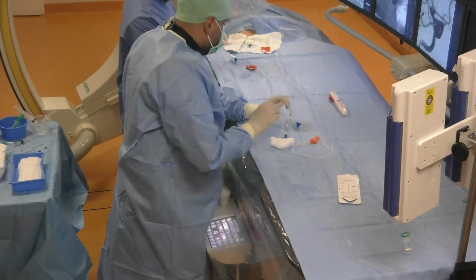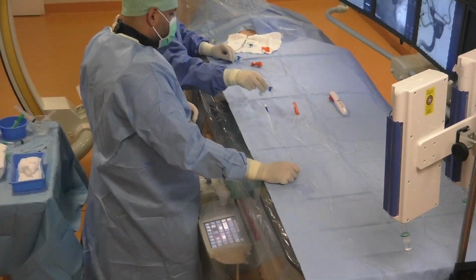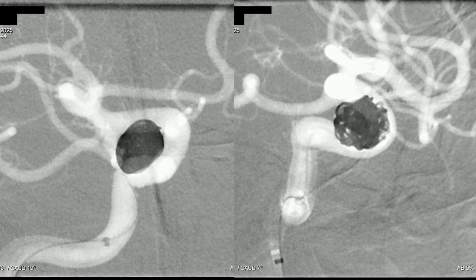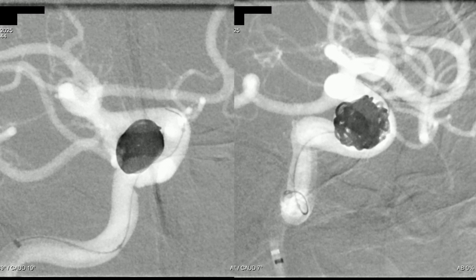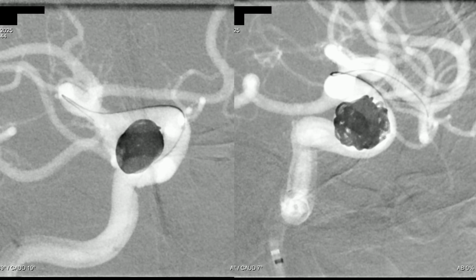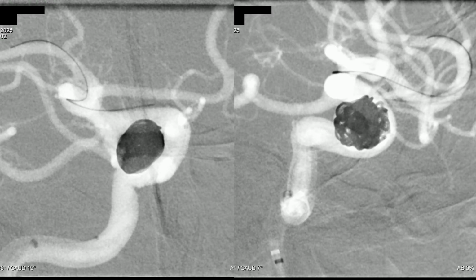We push the microwire inside the microcatheter and push them both into the intermediate catheter. And now we can navigate the way to the middle cerebral artery, and we navigate firstly with the microwire, and then we can push the microcatheter. And now we are inside the M2 segment, and we can push the microcatheter into the MCA.